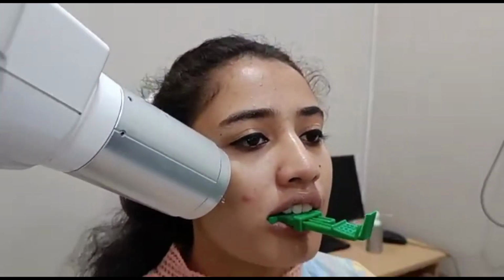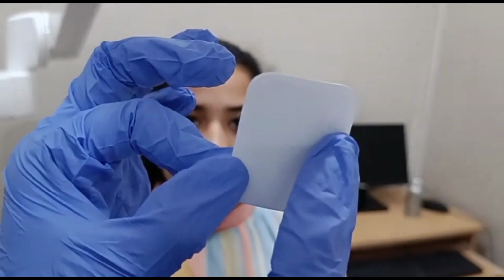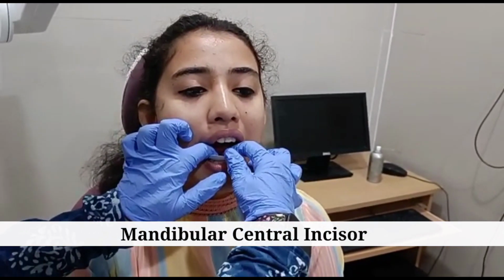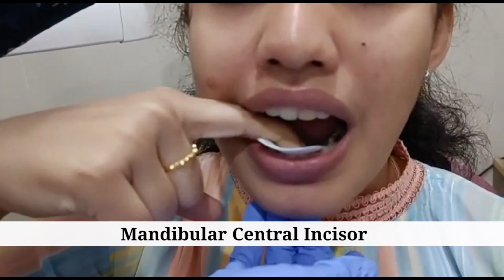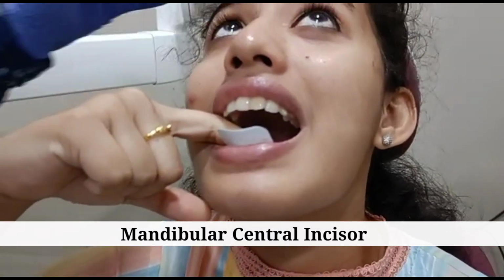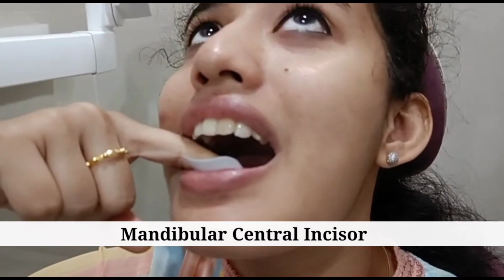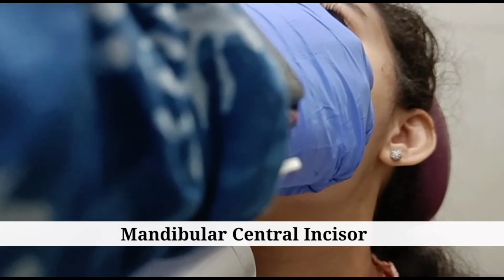Next we move on to the projection for the mandibular central incisors. You have to check the occlusal dot in such a way that it coincides with the incisal edge, and this is how we place the image receptor for the mandibular central incisor projection. You ask the patient to lift their head up so that the floor of the mouth is parallel to the floor, and we ask the patient to place the finger behind the image receptor, and always make sure the inferior surface of the receptor is touching the floor of the mouth.